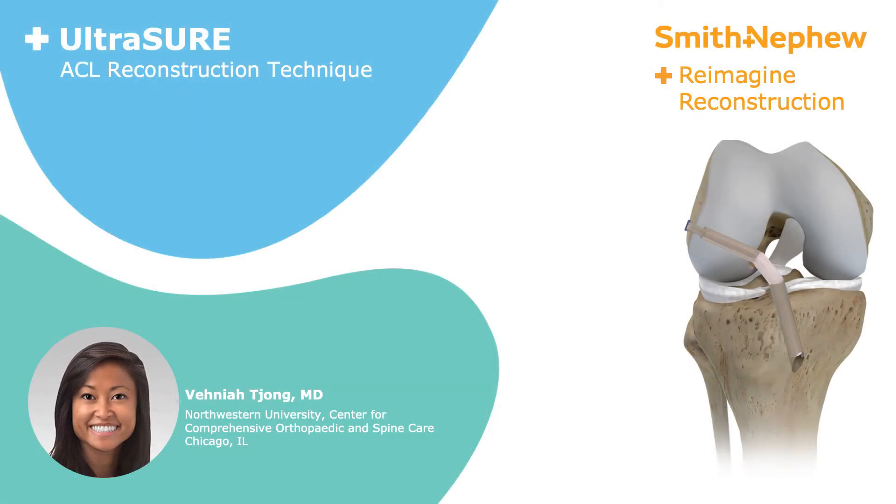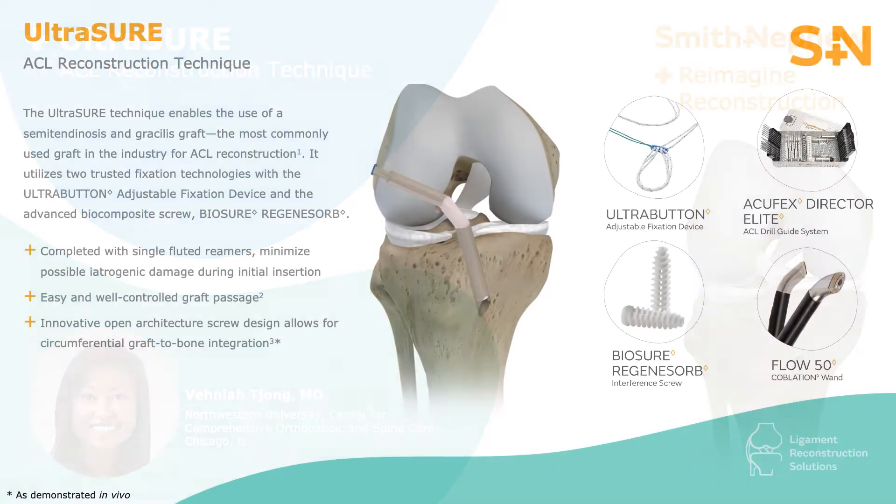This video demonstrates an ACL reconstruction with hamstring tendon graft using the ultra button suspensory device and the Biosure Regenosorb interference screw fixation. The femoral sided suspensory fixation is the preferred soft tissue technique as it allows the graft to have the appropriate aperture graft fit in the tunnel with suspension on the lateral femoral cortex. This femoral sided fixation has also been tried and proven well for years.